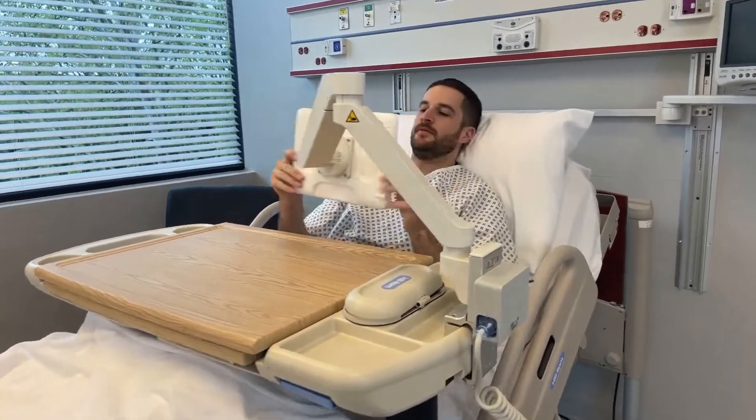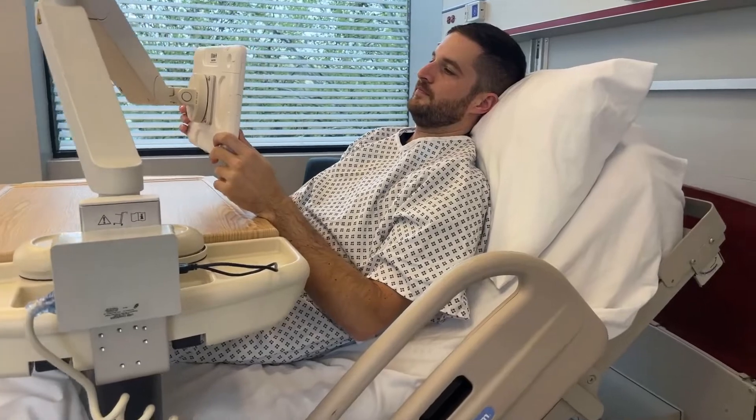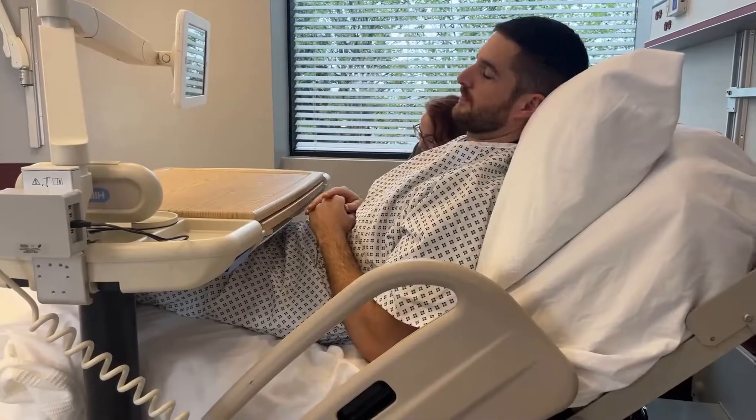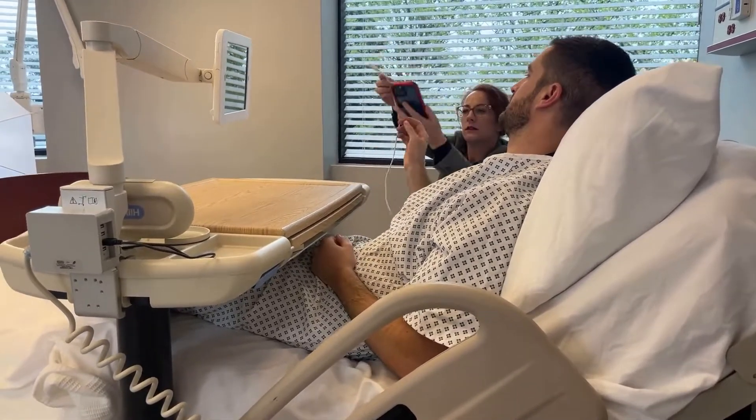The GCX VHMT tablet arm provides a durable and ergonomic medical-grade mounting solution for tablets made by Apple, Samsung, Microsoft, and others as part of healthcare organizations' strategies to improve patient experience.